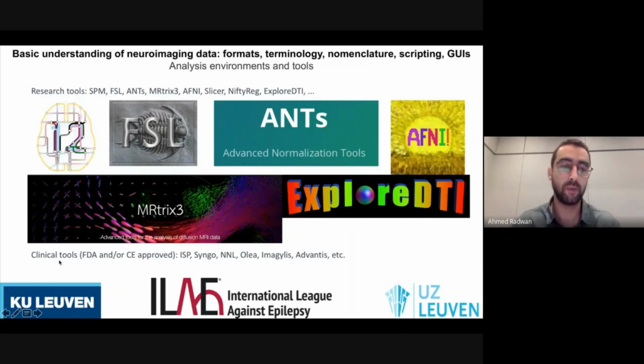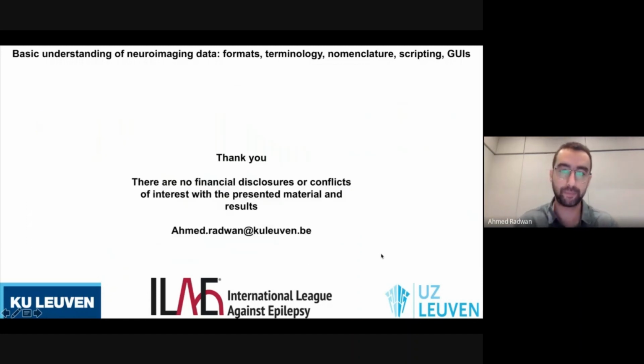And on the flip side, you have clinical tools which were developed by commercial entities such as Philips, GE, Siemens, Toshiba, etc. These will typically have an FDA-approved mark and also CE approval that allows you to use them in the clinical setting, both in the States and in Europe. I'm listing here some examples, but I'm not going to go into details about that.